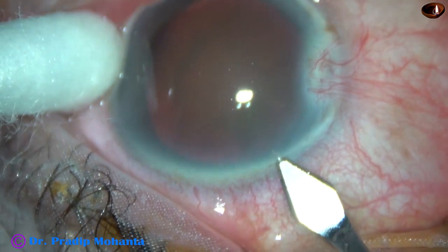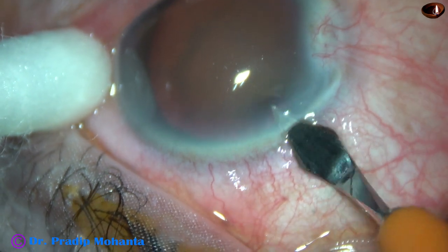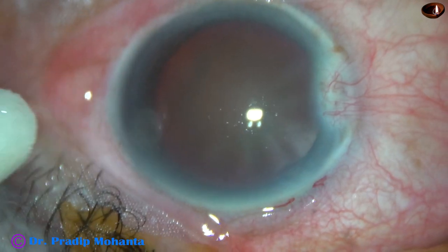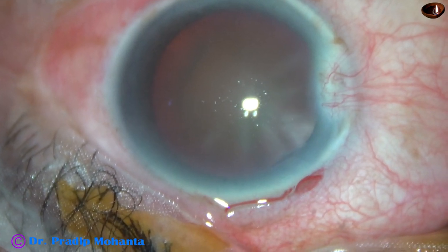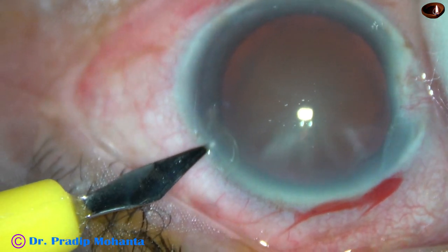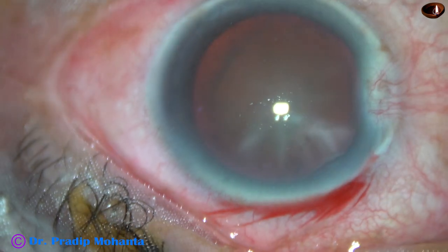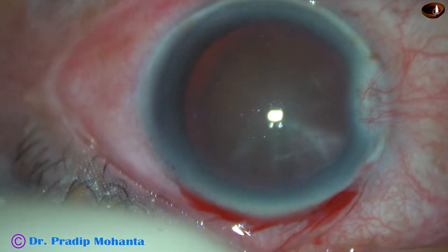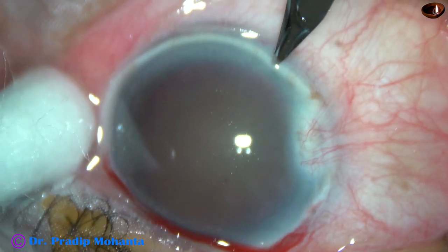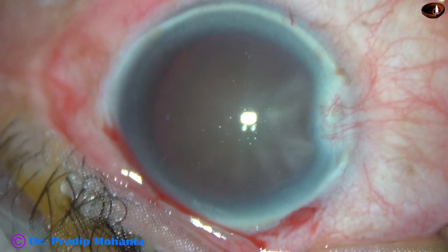This is the main incision with a 2.2mm steel keratome. A side port is being made on the left side of the main incision, about 3 clock hours away. Another side port is made on the right side of the main incision, about the same distance away. The side ports are 1.2mm in width.